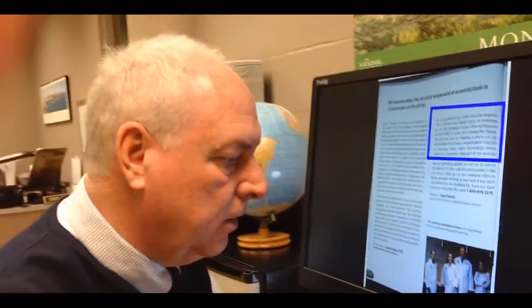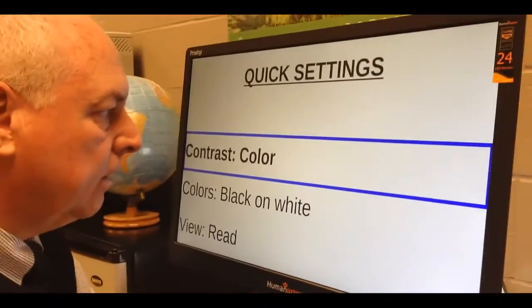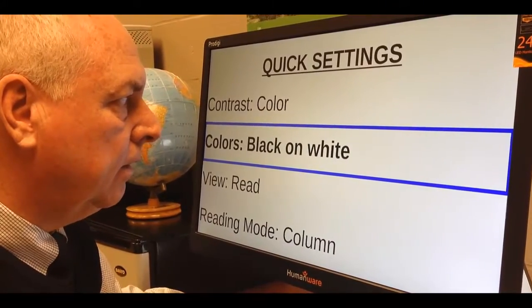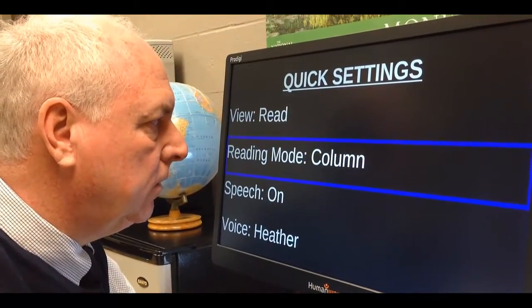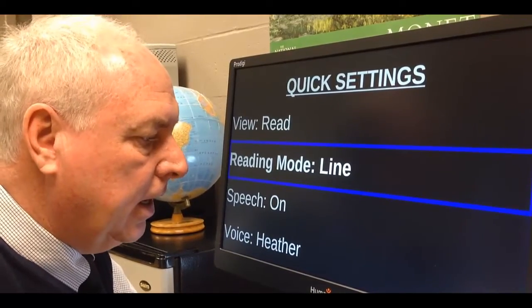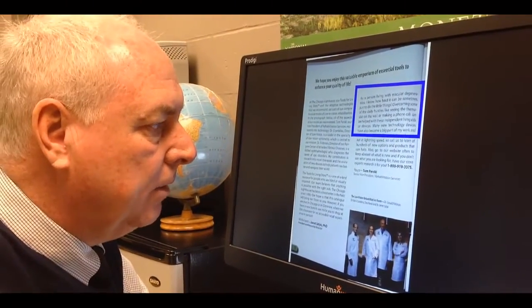There are some settings that you can do — what we call quick settings. By holding down the back button, you can go right inside the quick settings and change things like black on white. I can change it to white on black or many different colors. I can also change the reading mode. So let's say I want to read it in a line instead of a column — I just simply tap on that and then go back to my original document.